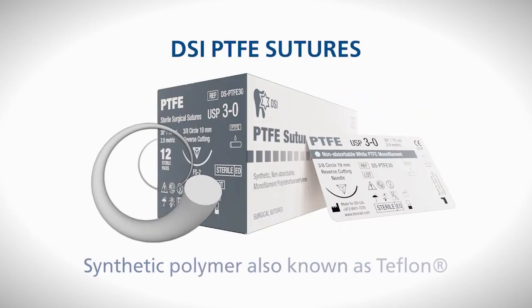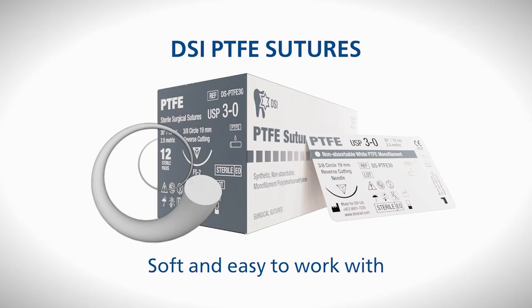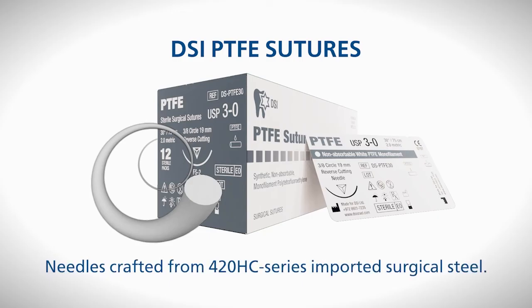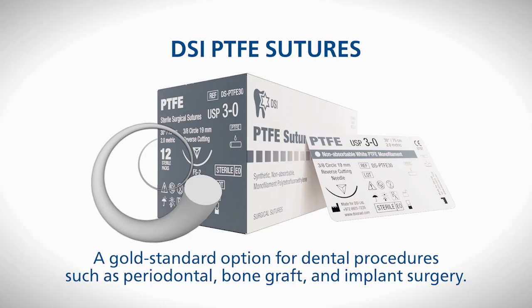DSI PTFE sutures, made of synthetic polymer also known as Teflon, are non-absorbable and biologically inert. They are soft and easy for doctors to work with due to their handling properties and knot security. The monofilament construction prevents bacterial wicking and the lack of additives reduces the chance of bacteria growth. Patients find these sutures particularly comfortable, leading to higher satisfaction rates. Crafted with careful attention to detail, DSI PTFE suture needles are made from 420HC series imported surgical steel alloy, sharp as a katana sword. Teflon sutures are considered a gold standard option for dental procedures such as periodontal bone graft and implant surgery.